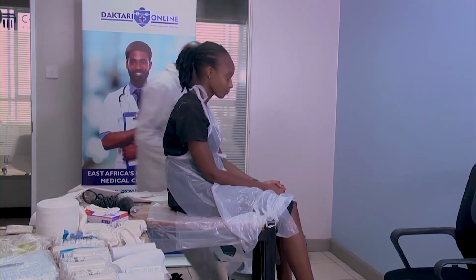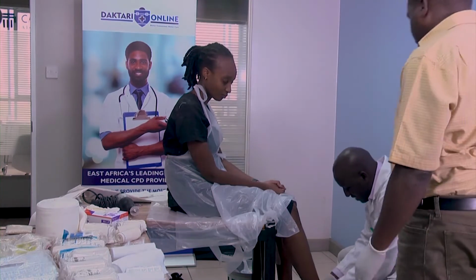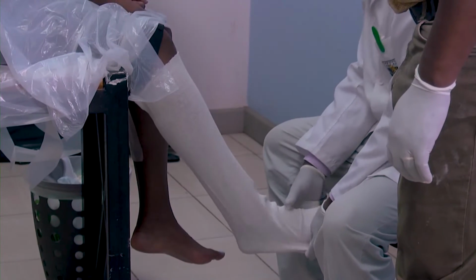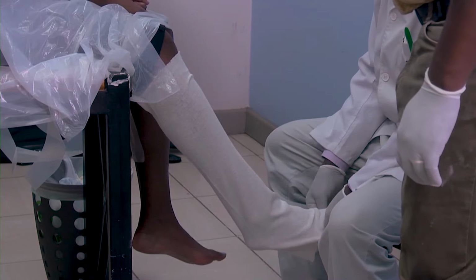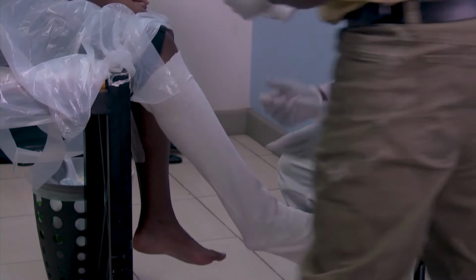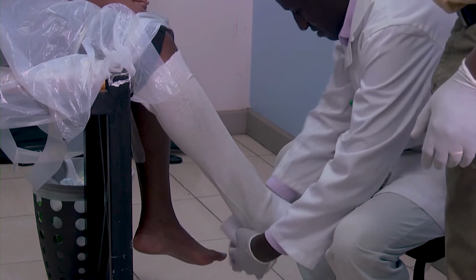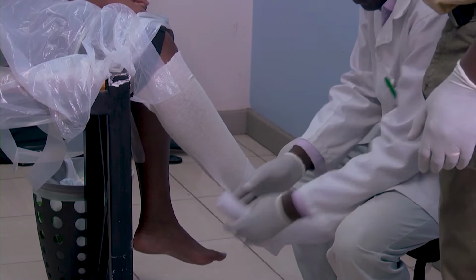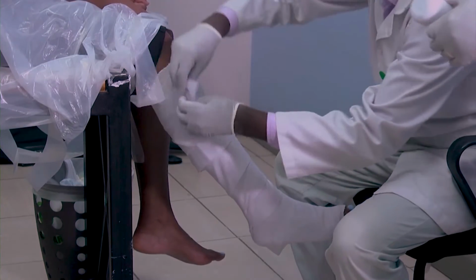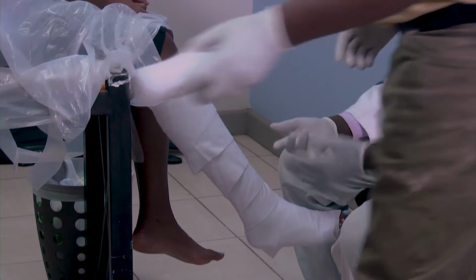What we start with is the stockinette. Stockinette should come in various sizes, small, medium, and large, because you'll be seeing various patients. The stockinette is the first one to be applied. Then we have our soft band, very important, applied with 50% overlap. So don't tie it just the way you apply the other ones. Remember, don't go beyond, because of the peroneal nerve at the head of the fibula.